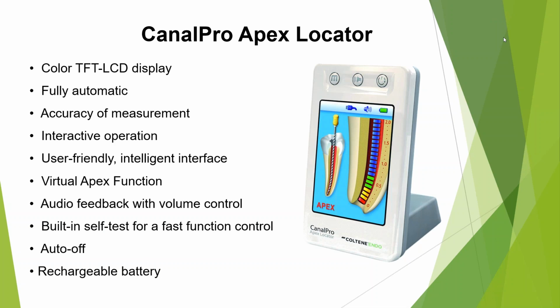We have 11 segments now, and I'm totally not the expert on talking about this because it was an aha moment from Dr. Gray about the apical zone. So 11 segments there and the 3 different colors, right? Can you get into the different colors and what they mean and how we should be talking about this in front of the doctor and what that actually means?